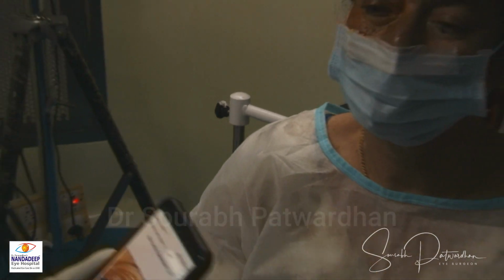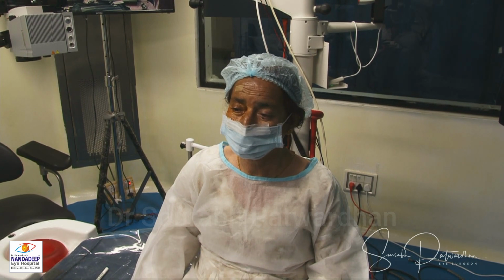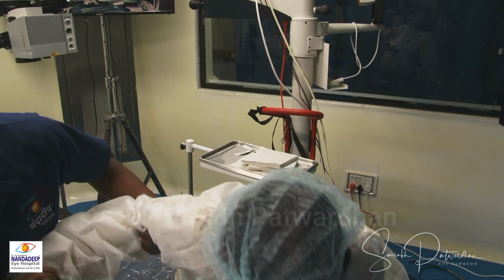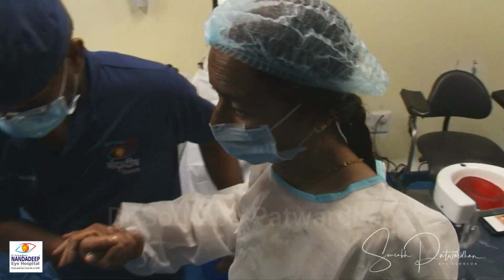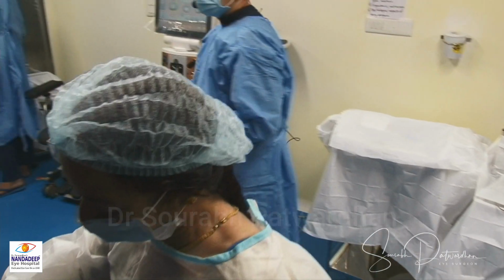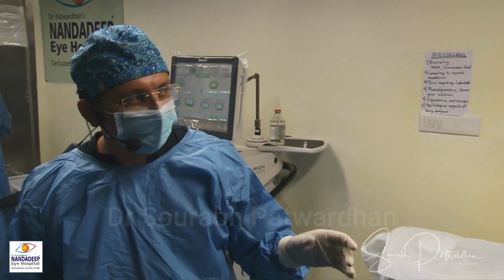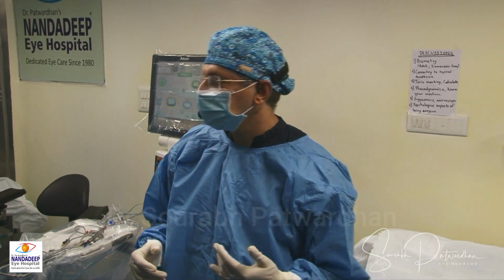We also have Callisto, so bring the patient to the table. I don't need any slit lamp marking or anything. Just before the surgery, I can do it or my assistant can do it very easily. We can even save these images, so even if we want to see later whether there was any error or something, we can see it again.